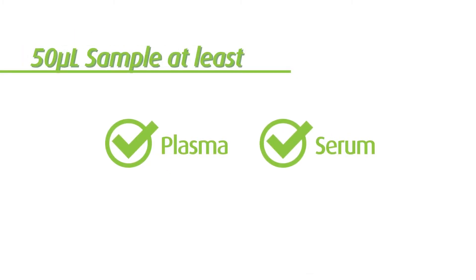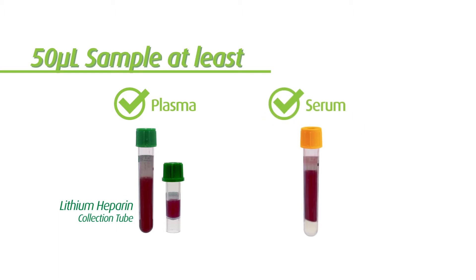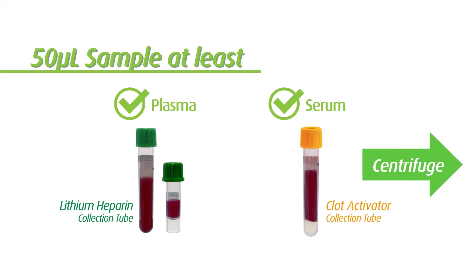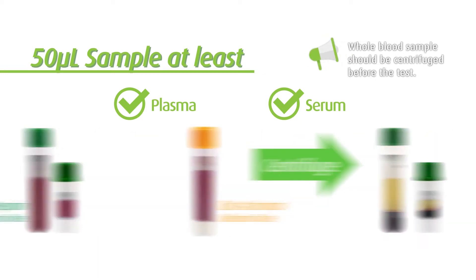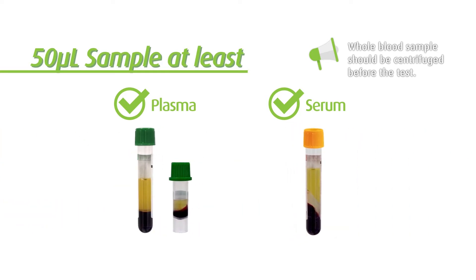The dilution tube contains 600 microliters of diluent. Before running the test, you need to prepare the sample. The supported sample type is plasma or serum. For plasma samples, please use a blood collection tube with lithium heparin. For serum samples, use a blood collection tube with clot activator. Blood samples should be centrifuged before the test can be performed. Please initiate the test immediately after the sample is prepared.